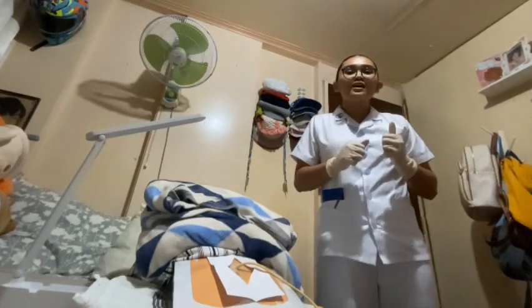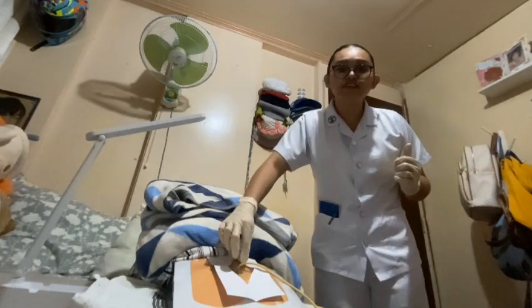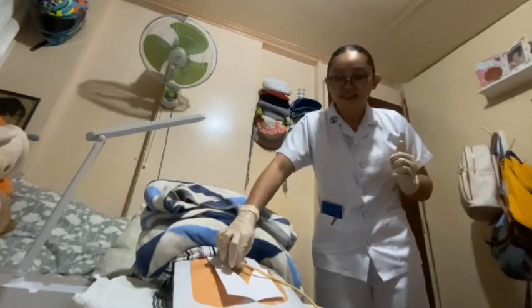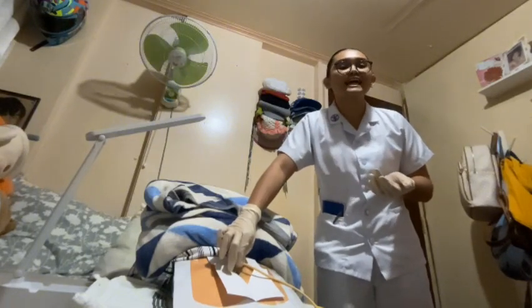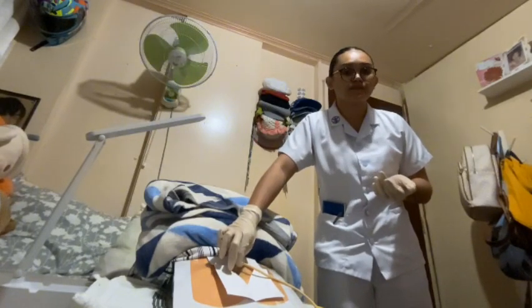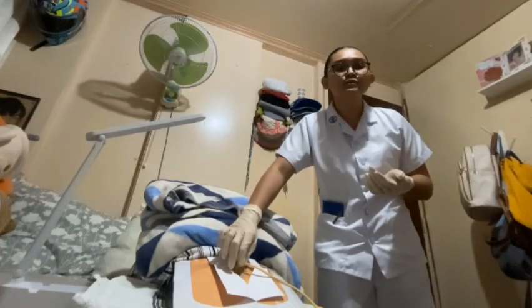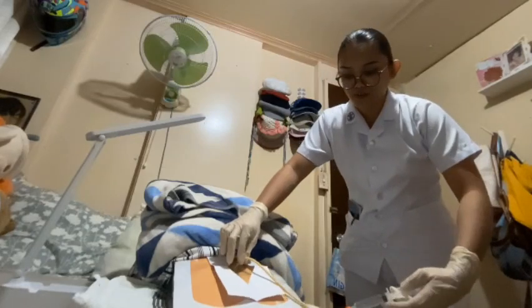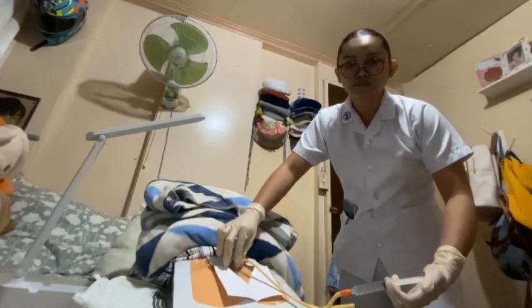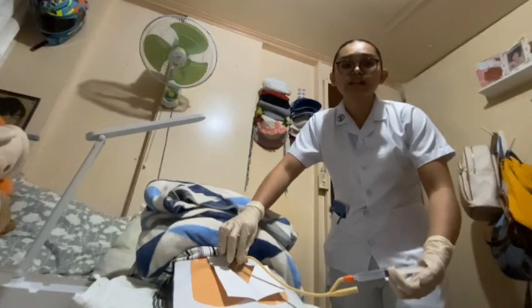Okay, now if specimen is to be collected, I will pinch the catheter using the non-dominant hand, thumb, and finger while placing the specimen container in position to collect a sterile sample without contamination. Now, after specimen collection, I will hold the catheter with the non-dominant hand and inflate the retention balloon with a designated volume. This is to secure the catheter inside the bladder so it won't slip out.